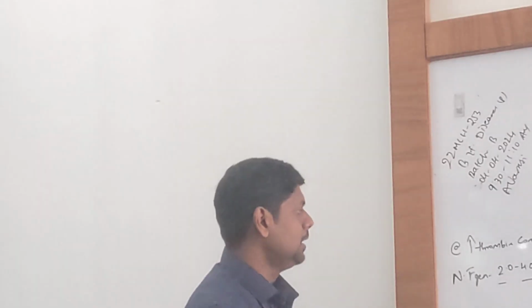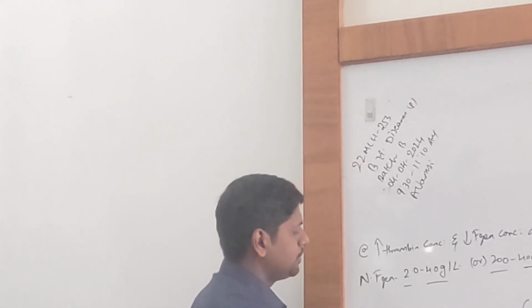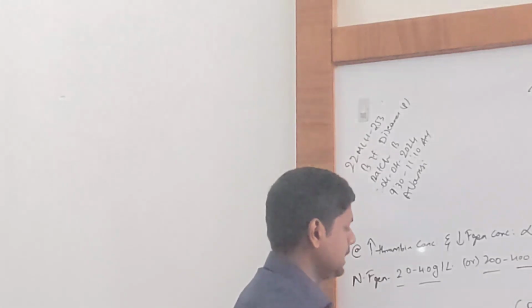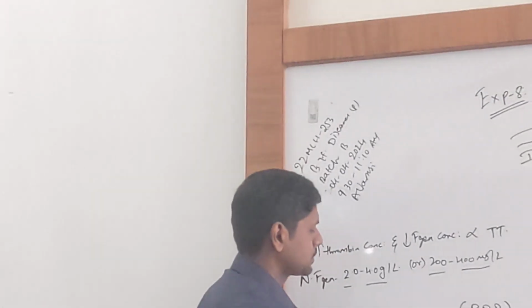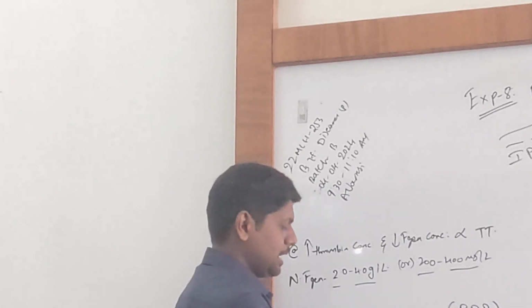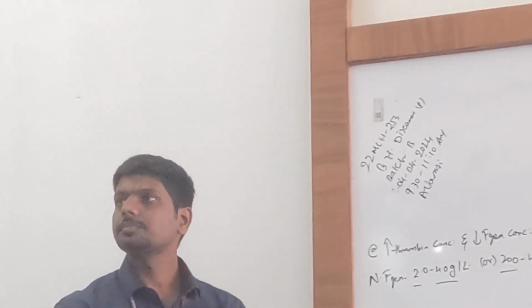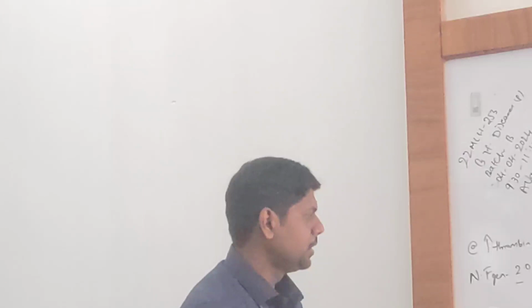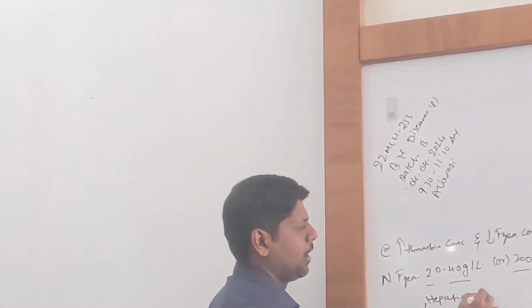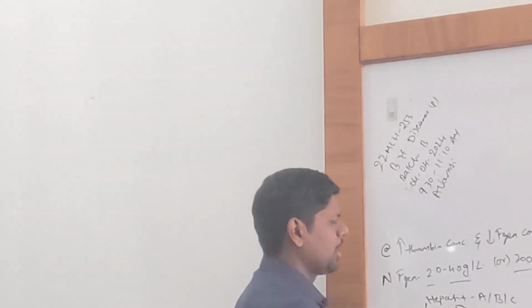Keep in mind, fibrinogen is secreted by the liver. The liver is the primary organ that synthesizes fibrinogen. Let us assume the patient has hepatitis A or B infection, even C infection, or he is severely alcoholic.